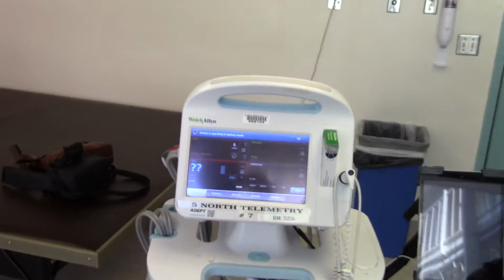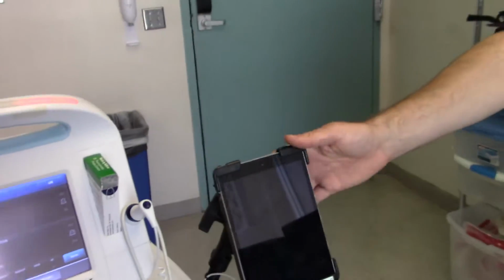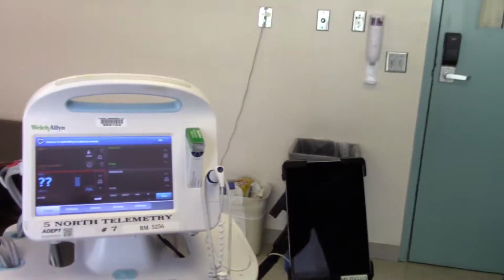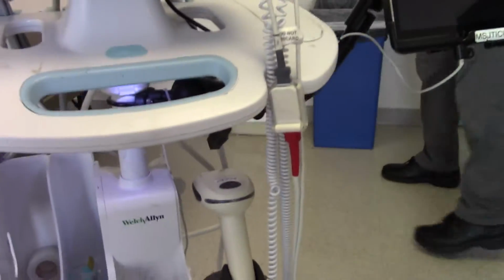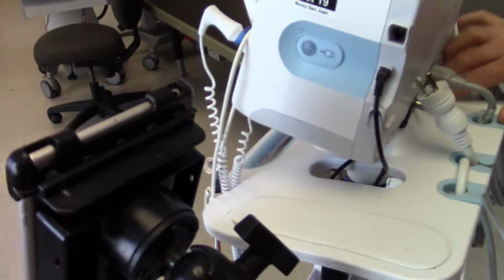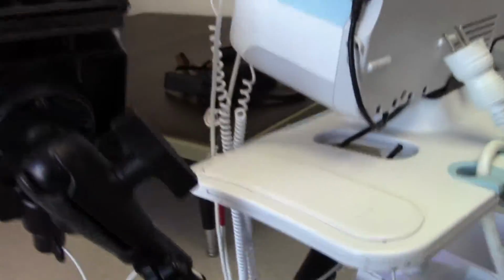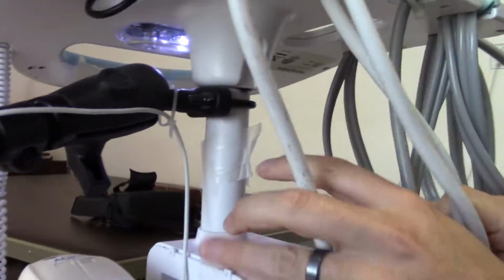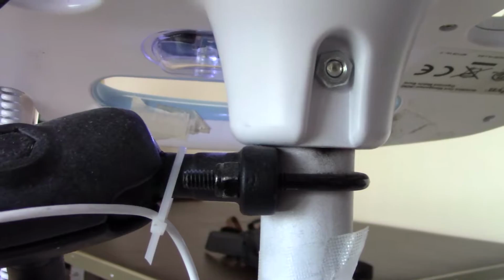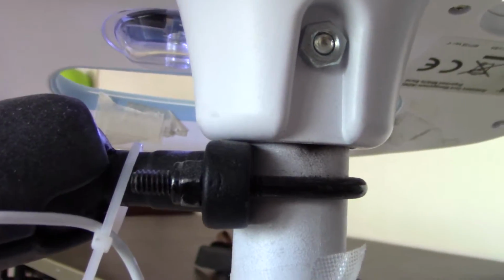Okay. So the iPad mounts on the side. You can see the scanners down below here. Okay, so the iPad's on the side, and let's follow that around for a minute. How is this iPad on here? So we can take a look on the side, and you can see underneath, especially if you come down, there's a little bracket here that attaches to the pole. I think this is a 1.25-inch pole or a 1-inch pole.